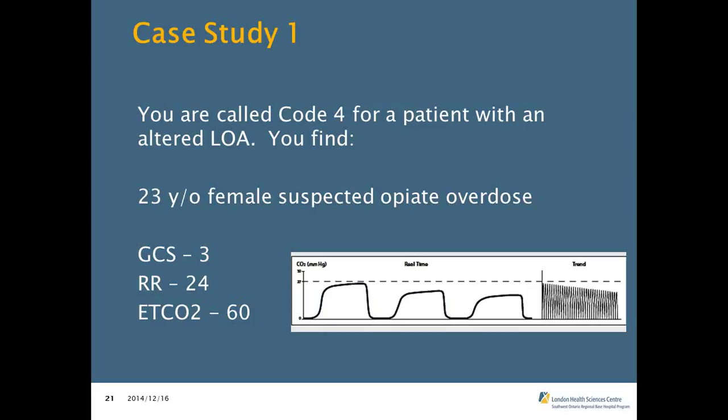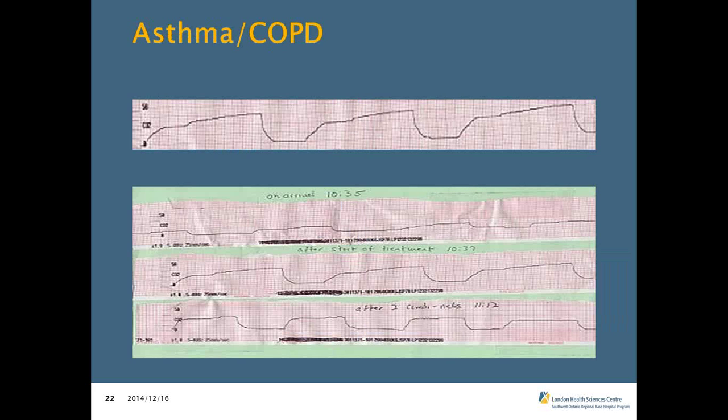And a difficult question to answer because there's all different reasons for a silent chest. So this is a good reason as to why you can't say, this is what it's going to look like in this case. You've got to know what's going on with the patient, what the history, what the physical is, what other vitals are to kind of put it in context to your patient.